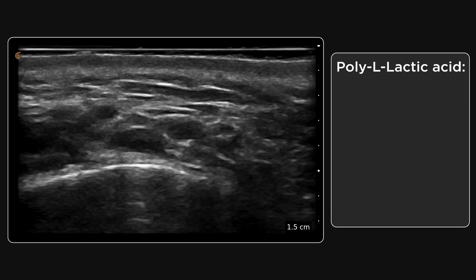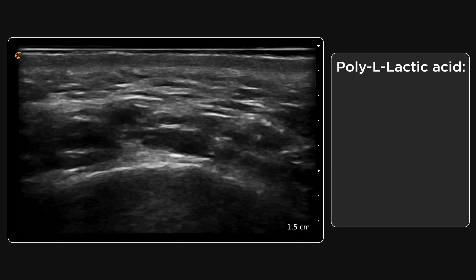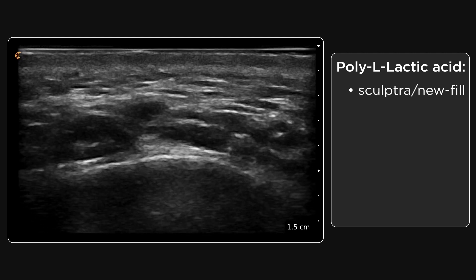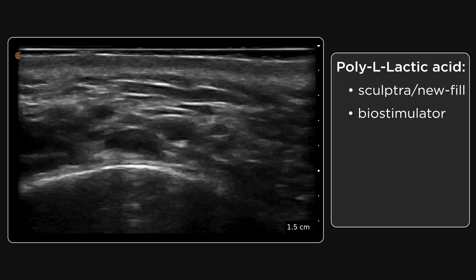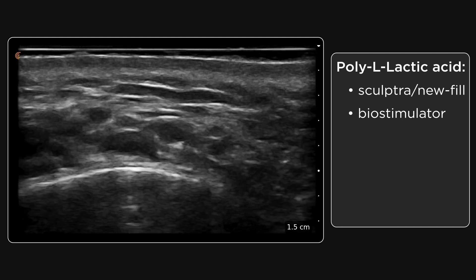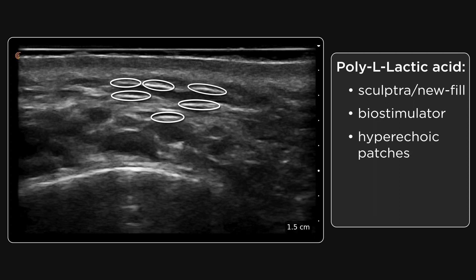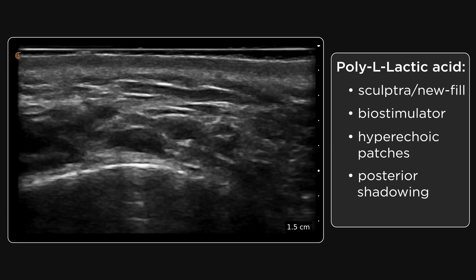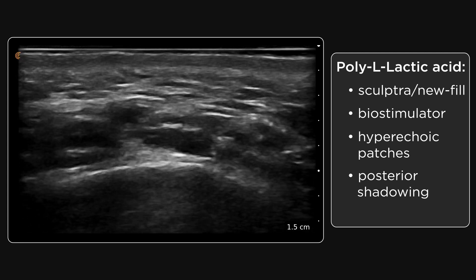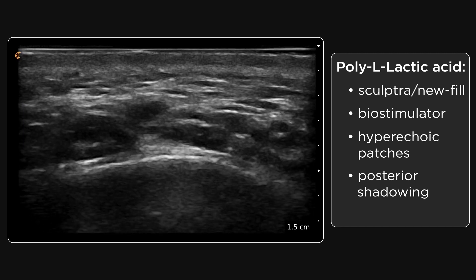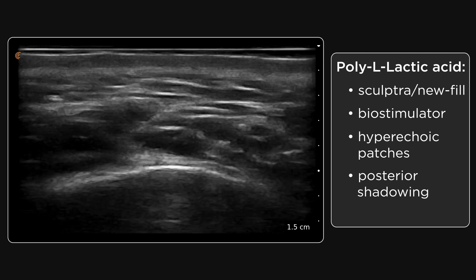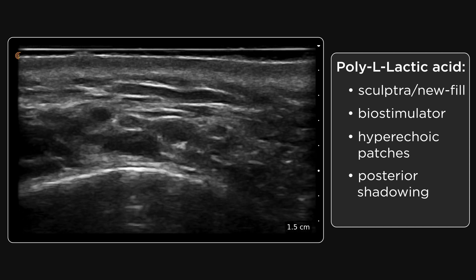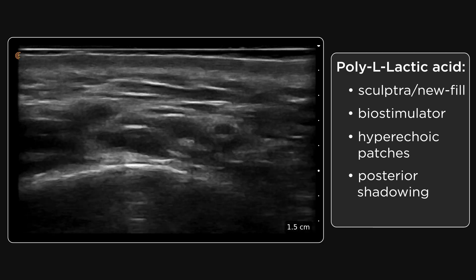This is poly-L-lactic acid. We know it by its common trade names of Sculptra or Nufil. It's a synthetic hydrophobic filler product which is a biostimulator. It causes fibrosis and on ultrasound it is characterized by widespread hyperechoic patches with slight posterior shadowing, giving rise to this diffuse dappled appearance. PLLA is not retained within the tissues as a deposit of filler but instead causes a fibrotic tissue response, and these hyperechoic patches are often only evident when comparing it to normal isoechoic fat tissue.